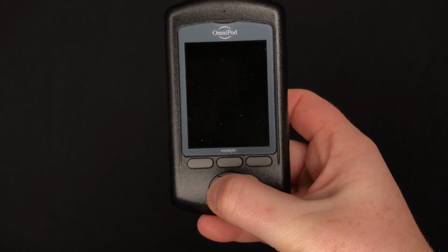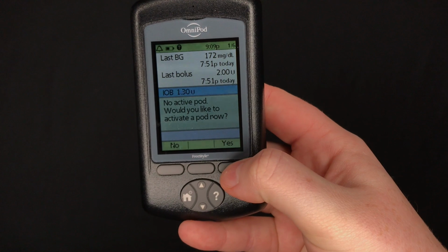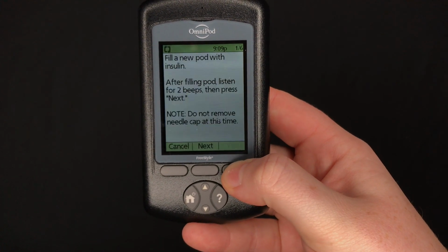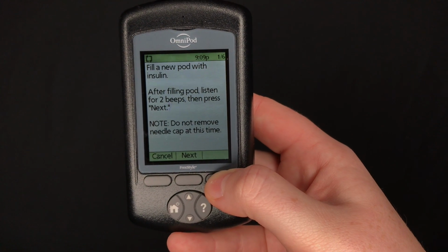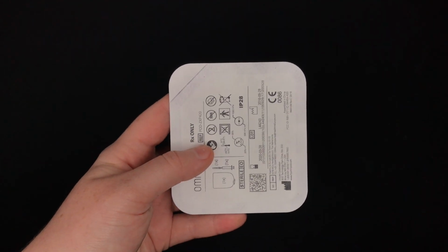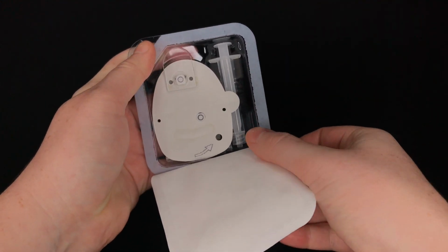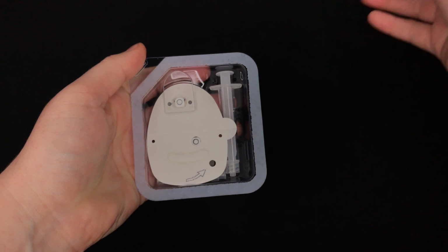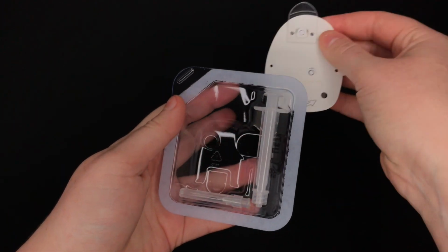Now at this point in the game, you've probably already deactivated your pod. So if you've done that, your PDM will probably ask you if you'd like to activate a new one. Once you press yes, it's going to prompt you to open up a pump kit and fill a new pod with insulin. So your pump kit is going to be a sterile package, and it's going to consist of a pod and a needle syringe and plunger.